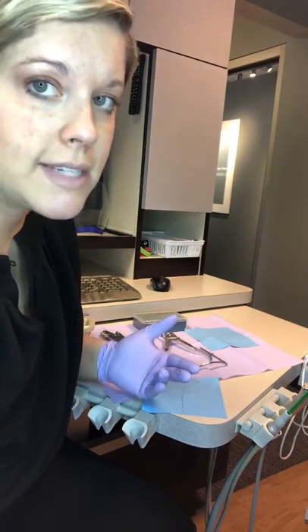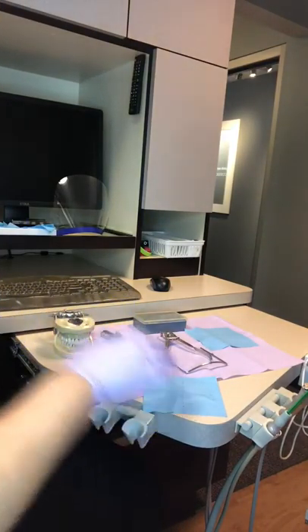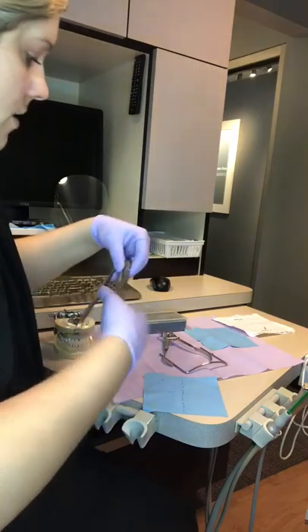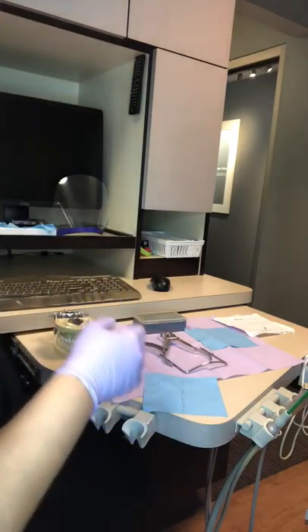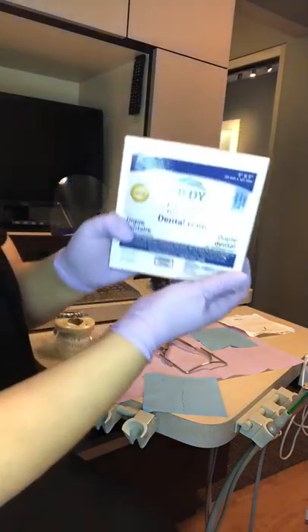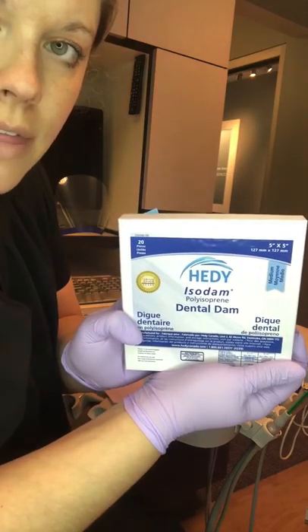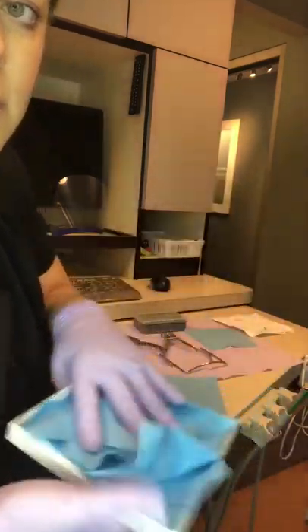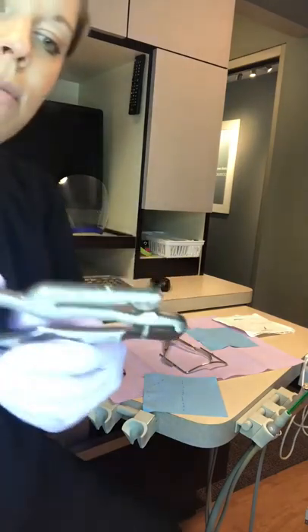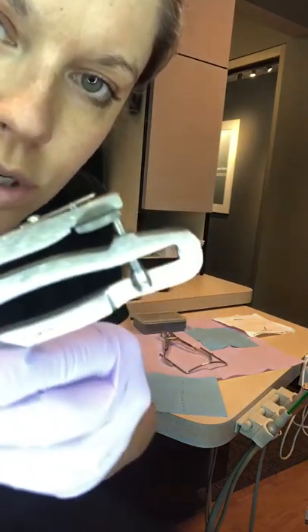What you need for your armamentarium: your rubber dam, and your actual dental dam — we use non-latex, our whole office is non-latex, though these do come in latex as well. We also have our rubber dam puncher, which is what actually puts the hole into the rubber dam.